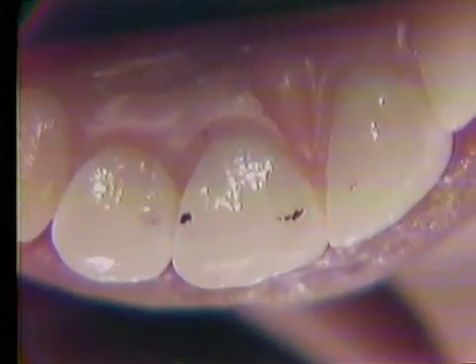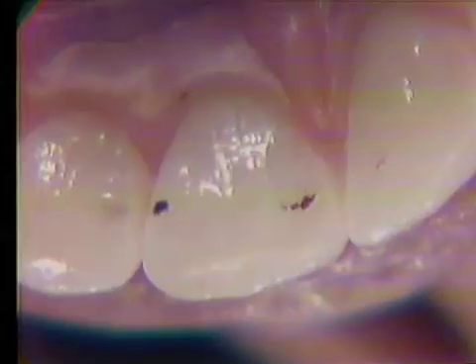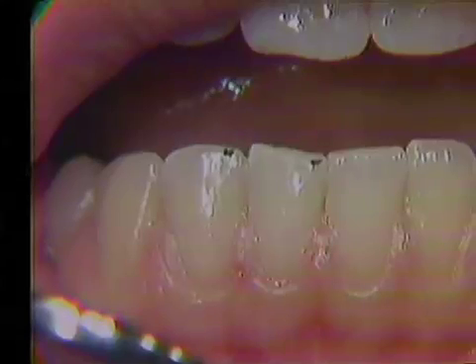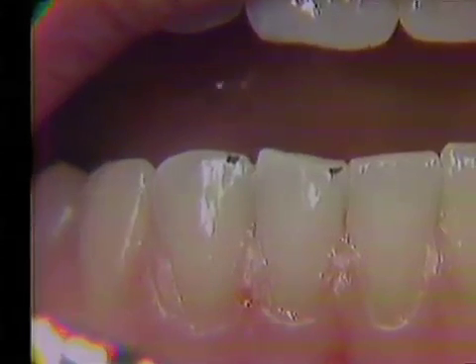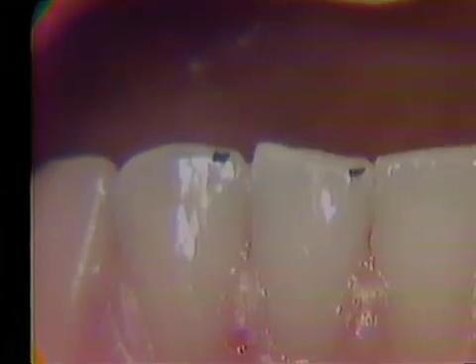The nature of the flat cusp tip will be studied when the working contacts are evaluated. The maxillary central incisor is viewed with a mirror. The centric stops are located on the mesial and distal marginal ridges. The position of the centric stops on maxillary anterior teeth varies due to the depth of the overbite. Stable contacts are located on the cingulum or along the marginal ridges. The mark on the mandibular central incisor is the supporting cusp contact with the mesial marginal ridge of the maxillary central incisor, and the mark on the lateral incisor contacts with the distal marginal ridge of the same central incisor.